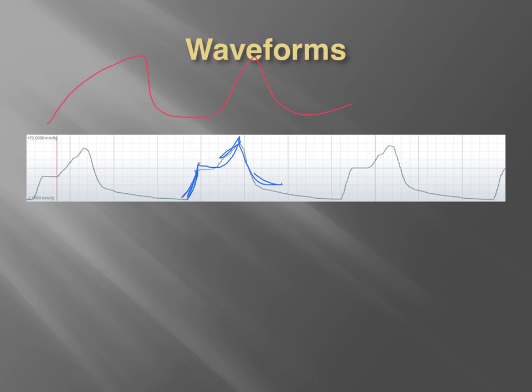So she may have been fighting us a little bit at this point, after resuscitation. However, this may also be that patient trying to overcome that carbon dioxide building up at really the level of the bloodstream and the alveoli, and it's being trapped by that restriction or constriction of the bronchioles, okay?